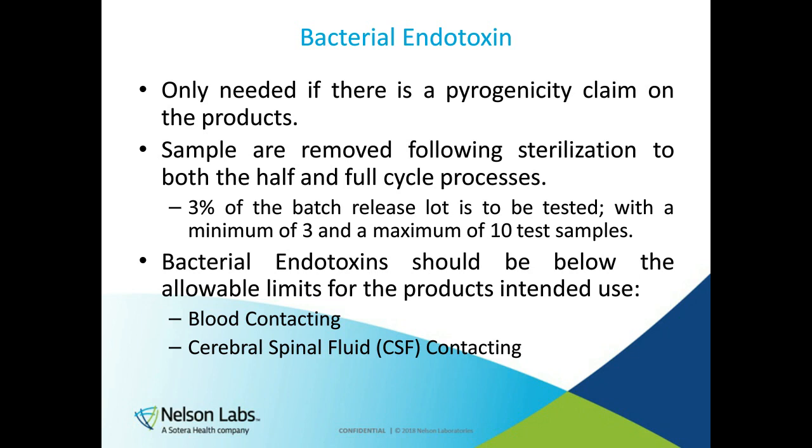Bacterial endotoxin testing is determined on how the product is used. If your product is blood contacting, then it will need to meet the criteria for blood contacting devices. If it does have cerebral spinal fluid contact or any type of brain matter contact, then you would have to meet the requirements for CSF.